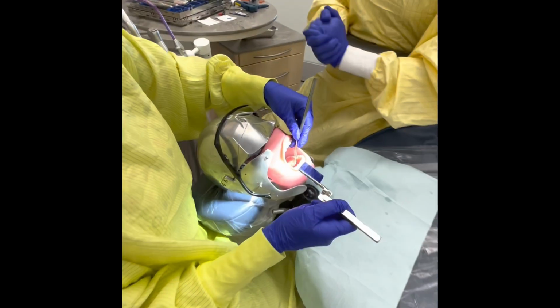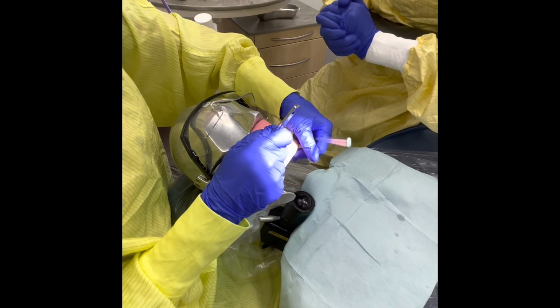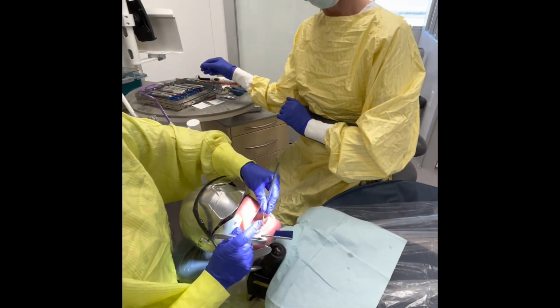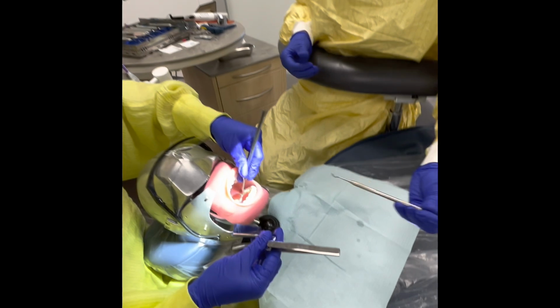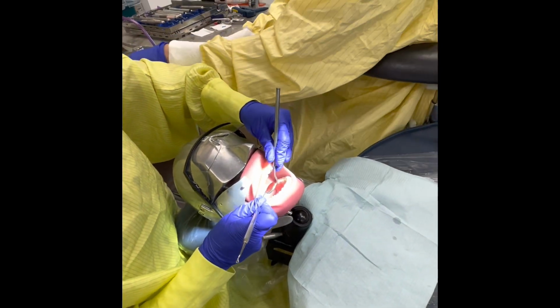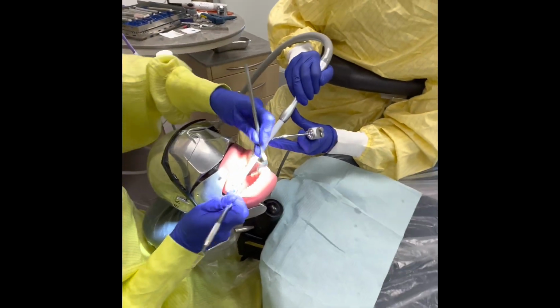I'm going to take my articulating paper, check my bite on that filling. Oh, it is high, Stacy. I would like to adjust it, please. What carver would you like? I'll take the cleoid end of my discoid cleoid, please. Okay. So Stacy's going to take the articulating paper, pass me my carver, and right away, she is going to go in and get her high volume suction, okay?